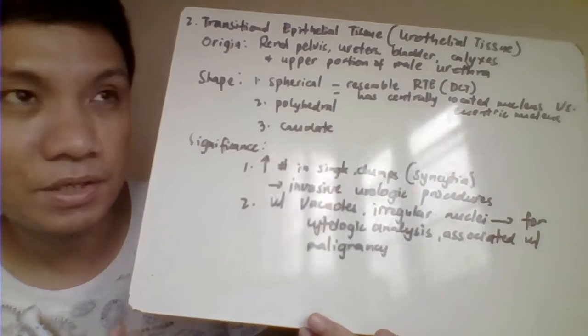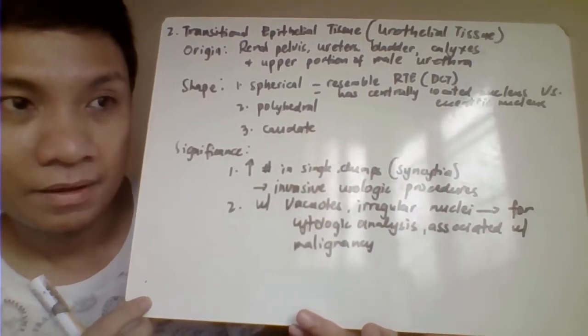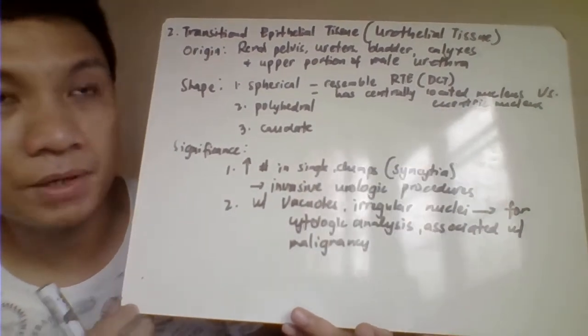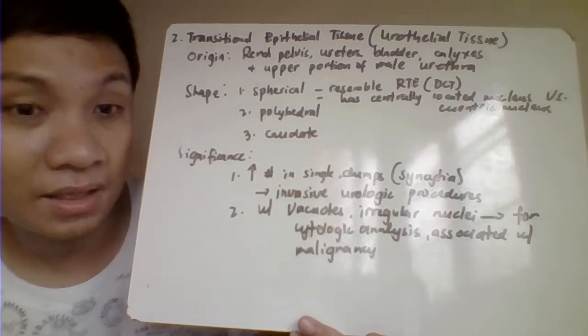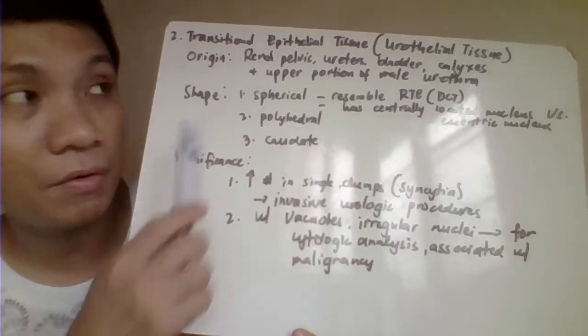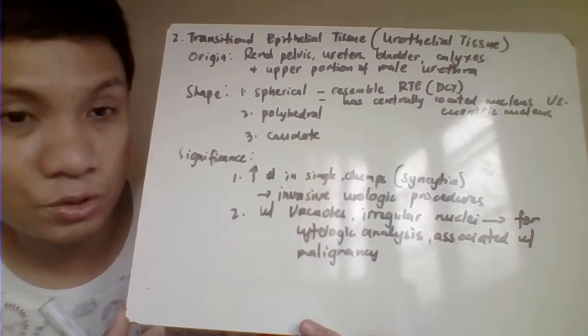Okay, so urologic procedures like, for example, naglagay ka ng catheter sa patient, so it might result in the presence of your transitional epithelial tissues.